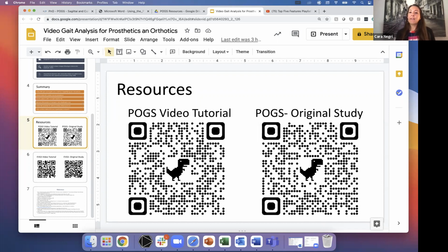So I always recommend taking that video before pulling me in, because it's really easy for me to give them the answer, to tell them, no, I think you do actually need to adduct the socket more. So I can use the video as a teaching tool in that way too, to show them what I'm really seeing. And that's kind of why I got into video, as a teaching tool, to be able to slow things down and say, that right there, that's the reason I'm going to adduct the socket. Is that what you see? Because when you have a patient walking, they're walking so quickly that it's hard to slow it down to be able to explain what you see.